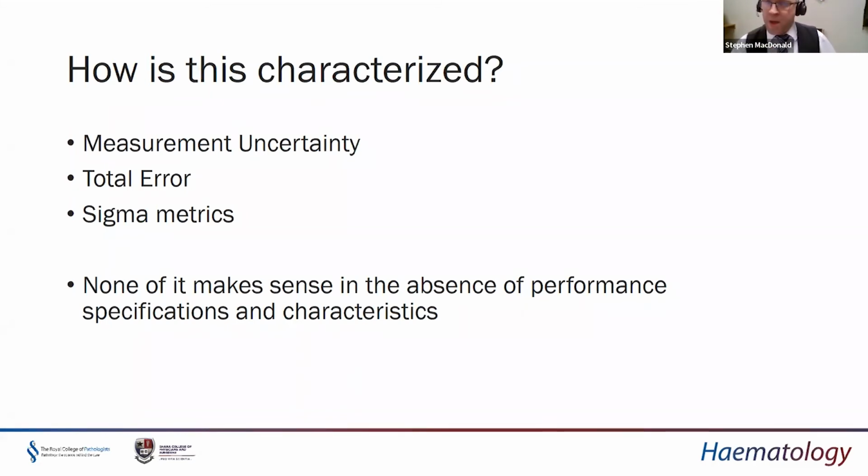standards. That being said, there are different approaches, because measurement uncertainty does not incorporate bias as a measurable quantity into the degree of error. Measurement uncertainty assumes that systematic error, if it has been identified, by systematic error I mean bias, has been corrected for, and only the uncertainty associated with that correction is incorporated into the measurement uncertainty calculation. Something that does incorporate systematic error are the metrics which are favored across in the US, things such as total error, total allowable error, which incorporates imprecision and incorporates systematic error as well.